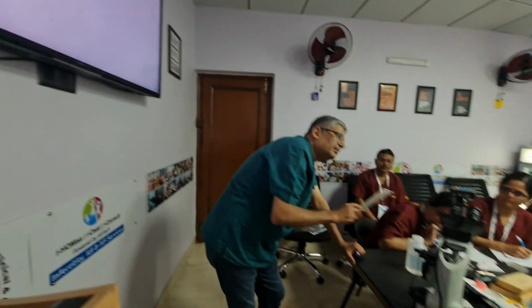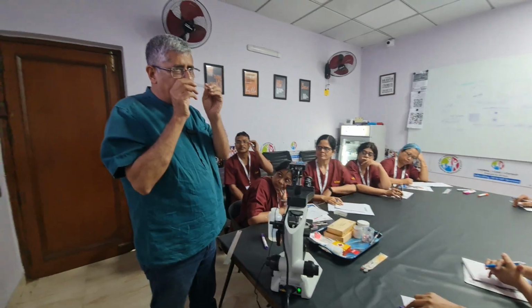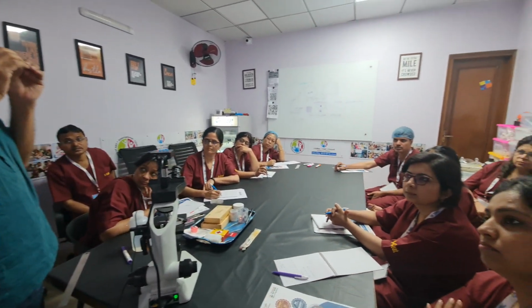What you need to see here is the height of the objective lens from the platform. Till 20x you can use it. The height of this glass slide is 1.2 millimeter plus a 0.13 millimeter cover slip, and a 10 micrometer chamber of semen sample.